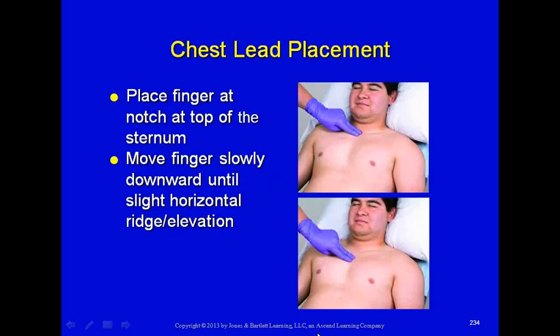In order to place the leads properly on the chest, there should be some sort of standard format, or some standard routine, that you go through each and every time you hook up the 12-lead ECG. And here we're just talking about standard lead placement for a standard 12-lead. We're also going to address right-sided 12-lead ECGs as well as posterior ECGs. But initially right now we're just talking about a standard 12-lead ECG.